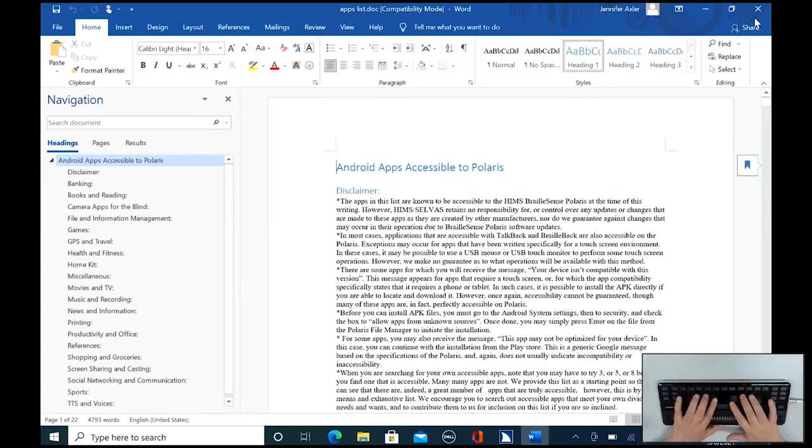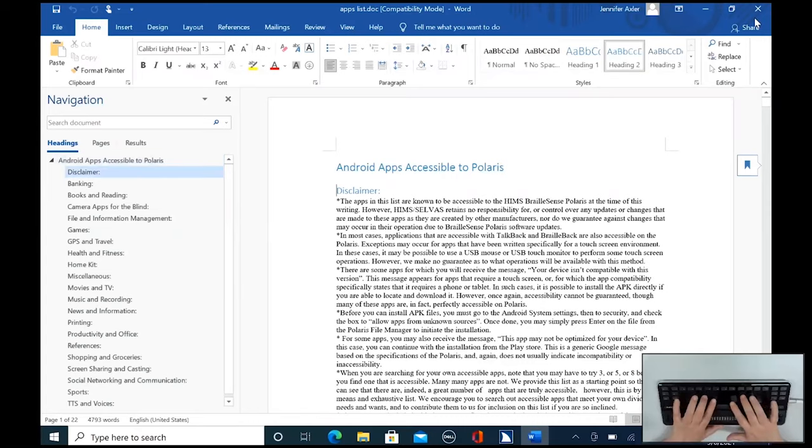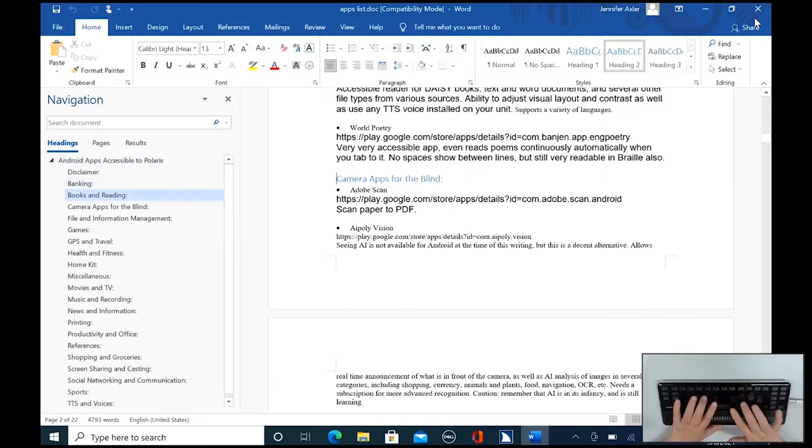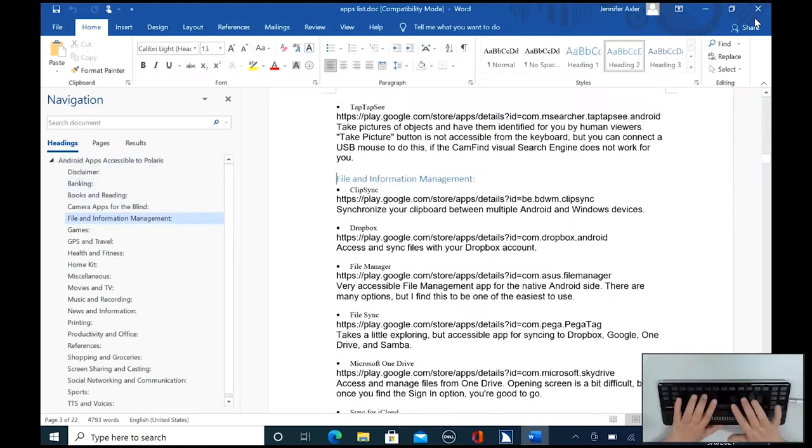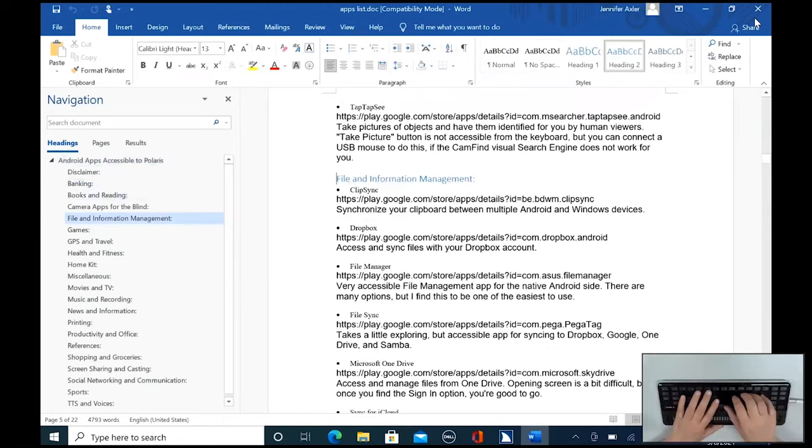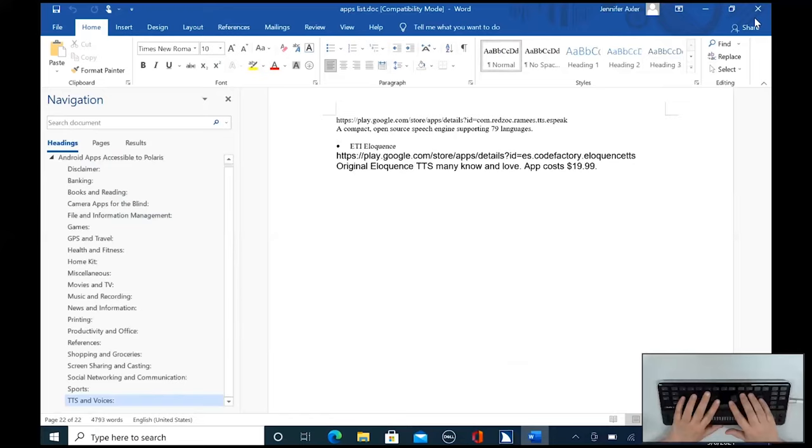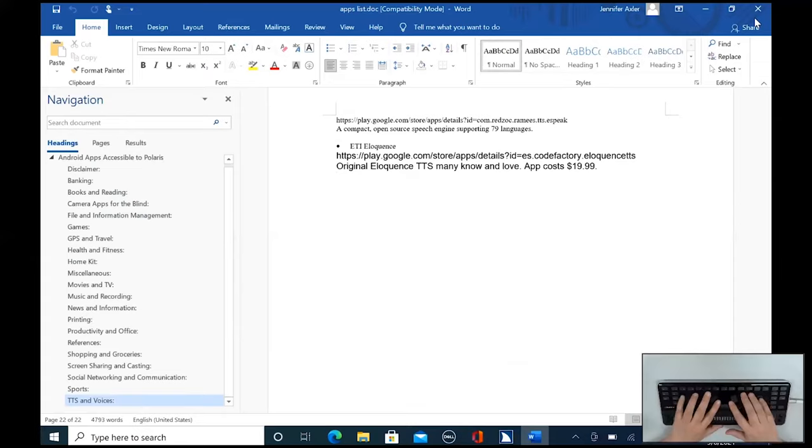And now, again, I can just use the keystrokes I know. So I can type H and move through this document. And if I want to go to the bottom of the file, I can just press space four, five, six. I could have also pressed control end as you normally might. And again, this again is the advantage of this keyboard is that it's intuitive no matter how you look at it. Whether you are using Braille keystrokes or whether you are using a combination. Or if you want to know that strange control alt one keystroke, you don't have to think about it. It is control alt one.